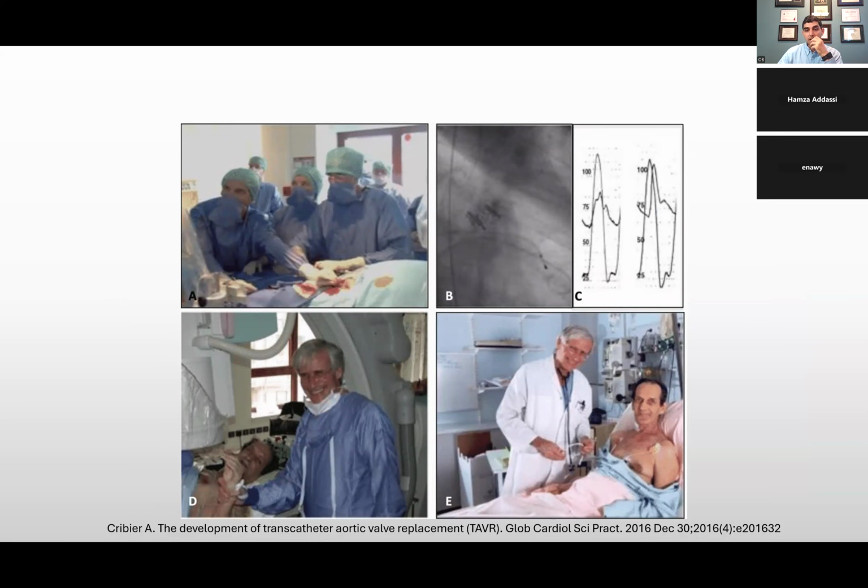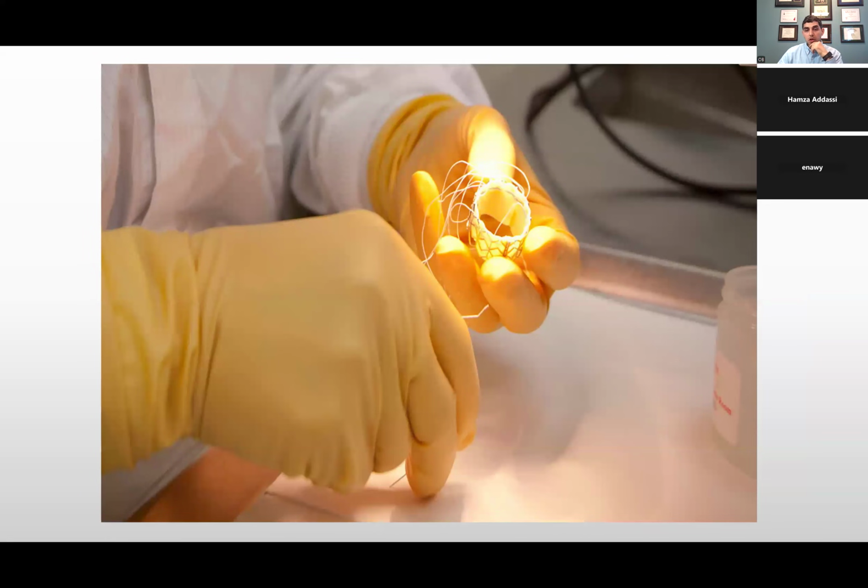This is Dr. Alan Cribier, who passed away not too long ago, but he was the first one to do it. So what is the valve? The aortic valve is made out of the pericardium of the cow. Every day a mass shipment of cow pericardium gets shipped to three factories for Edwards and other factories for the other valves. They process the pericardium.